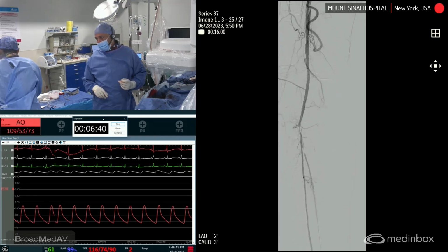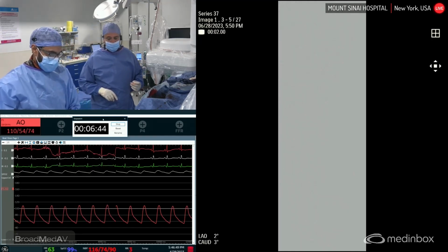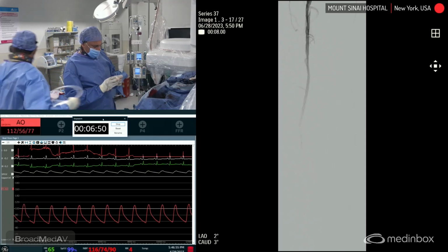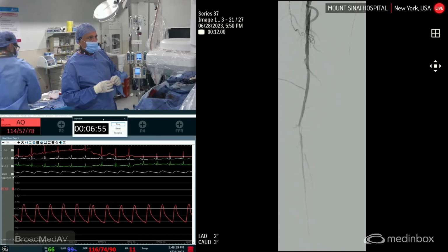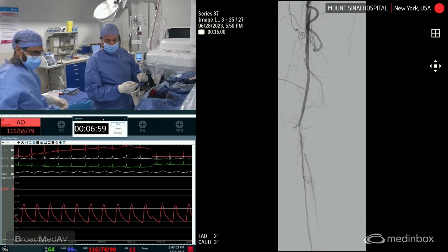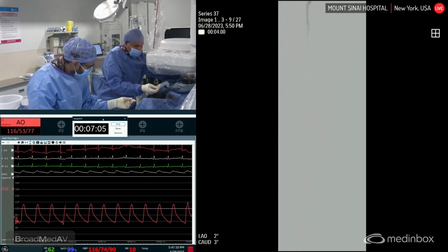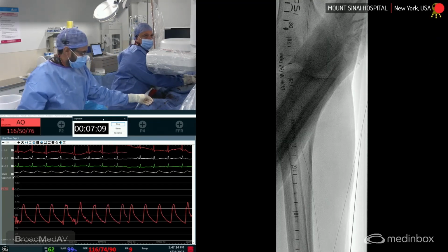If I was to do something at this stage and I had a bioabsorbable stent, I think this is an ideal case for one. Put it there, take care of the lesion and prevent it from occluding. If this does occlude, then it does jeopardize my result. So I'm going to wait for the audience to tell me what they think I should do. Any responses, Liz? Okay, nobody's responding. Nobody's helping us out here, Ibrahim. So I think you and I are going to have to decide what to do.